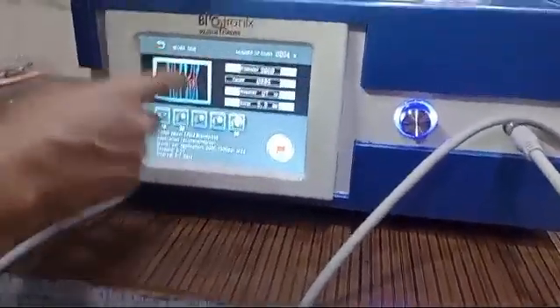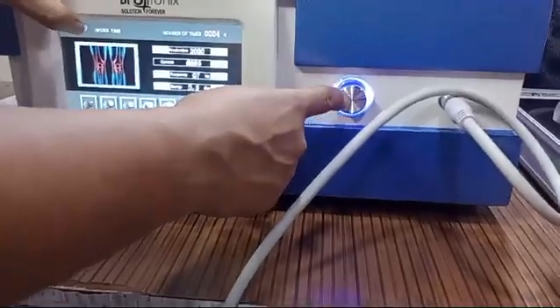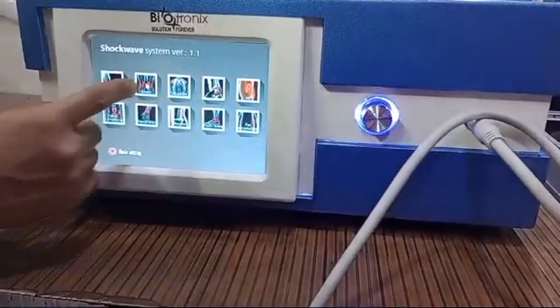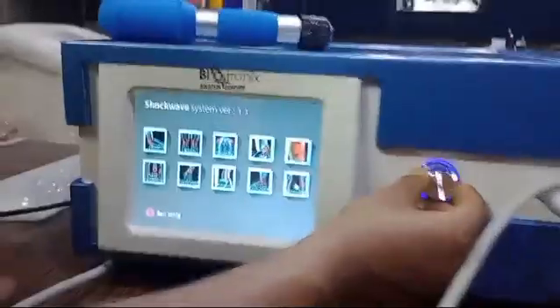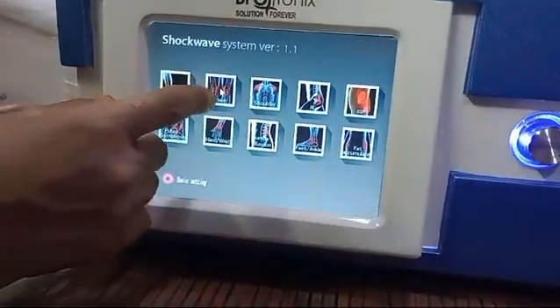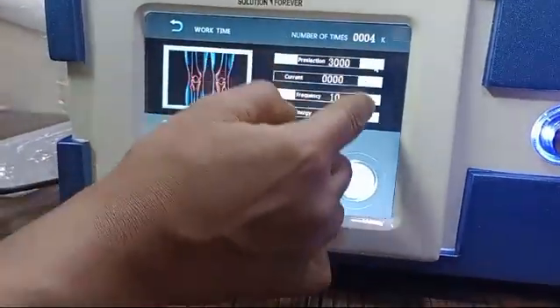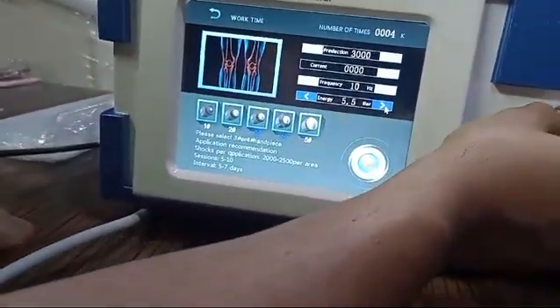This is a touch screen. If I don't want to use the touch screen, I have the option of the mouse over here. You can see, if I rotate the mouse, the pointer will move around. So when I put the mouse on the knee, I have to press this and it will be selected. You can increase or decrease with the mouse. So it is mouse operated as well as touch screen operated.